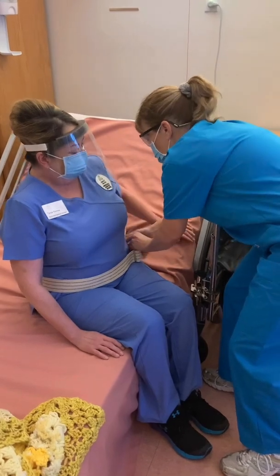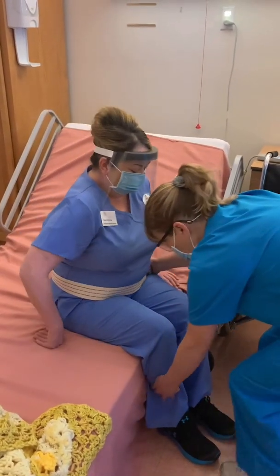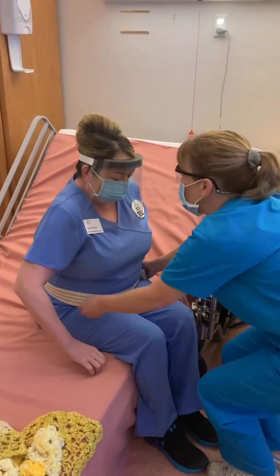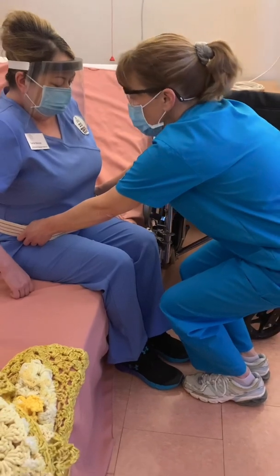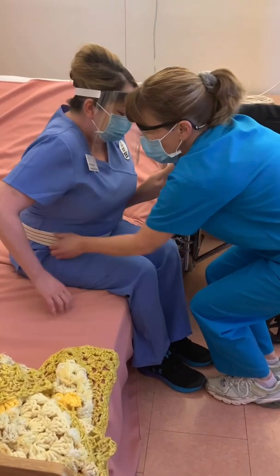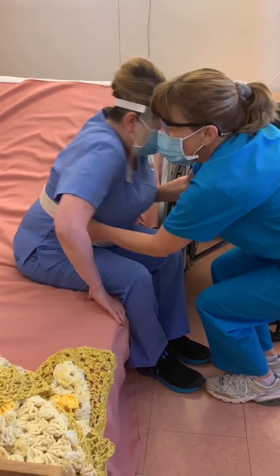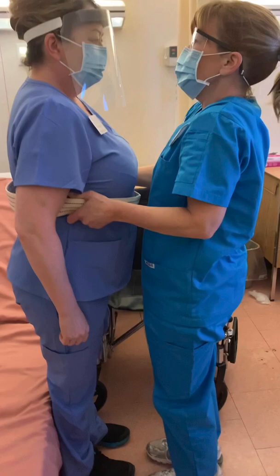There we go. Okay, so what I'm going to do is get you to put your feet right next to mine so I can stop you from slipping. Okay. I'm going to bend at the knees. And on the count of 3, I'm going to get you to lean forward and use your hands to push you up. 1, 2, 3. Good. How are you feeling? Fine. You're not dizzy or anything?